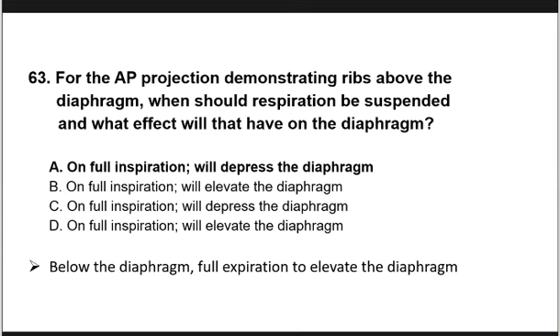Bababa ang diaphragm. If we are going to demonstrate the ribs below the diaphragm, the instruction given is full expiration. Pag sinabi natin full expiration, labas ang hangin, pigil, tataas naman ang diaphragm, or the diaphragm will elevate.